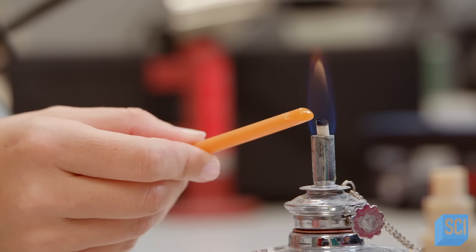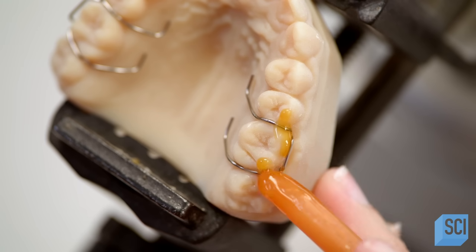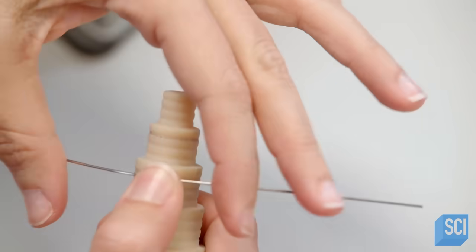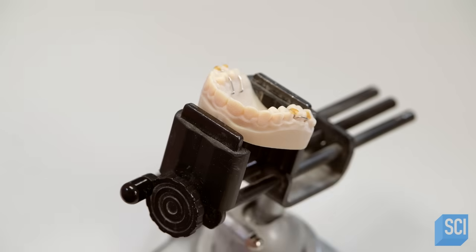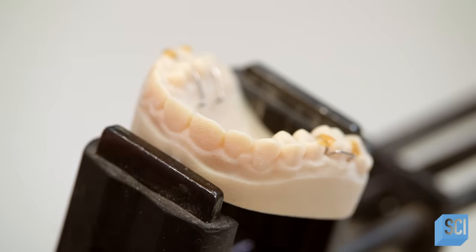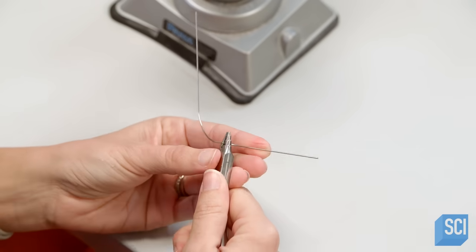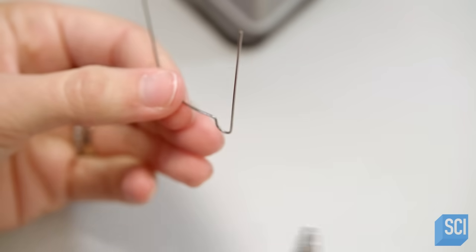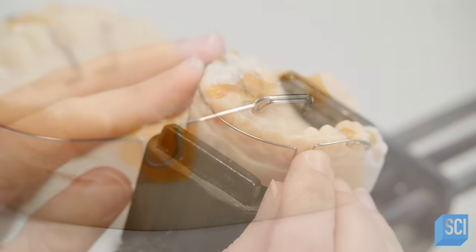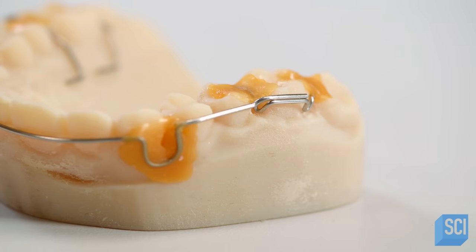Once both clasps are in position, the technician secures them with sticky wax. Next, she assembles the front of the retainer called the labial bow. To do so, she bends a piece of wire against a form, then marks where to bend the wire to create an adjustment loop on each side. The labial bow is secured to the model with wax.